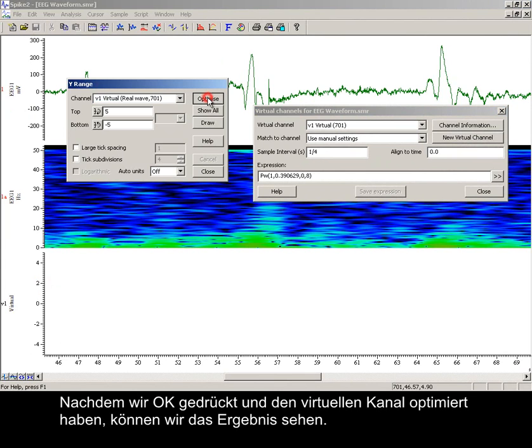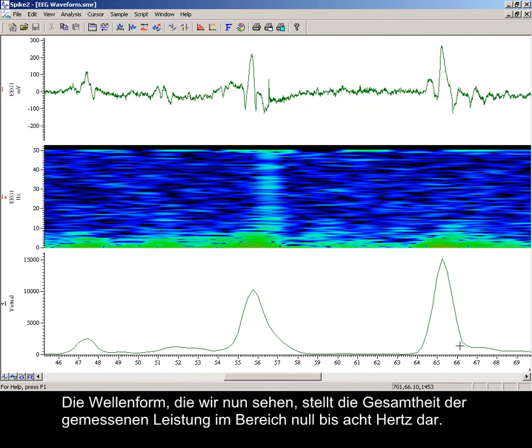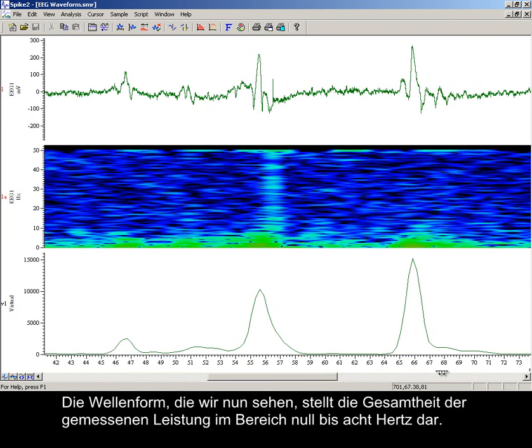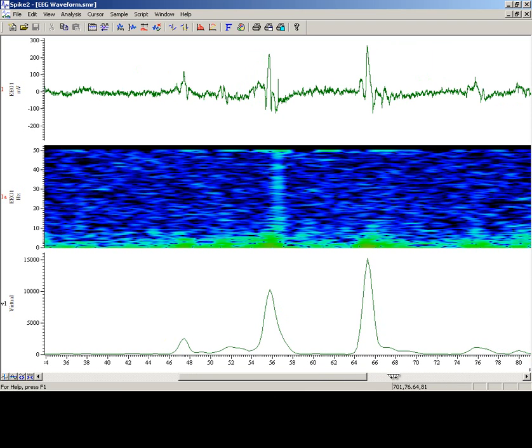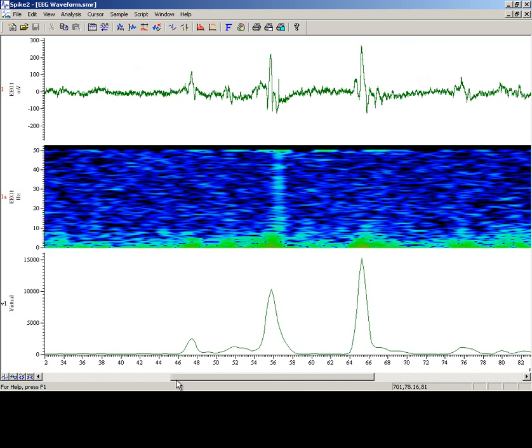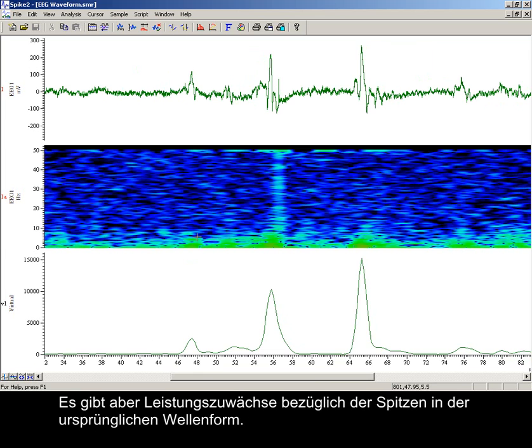After pressing OK and then optimizing the virtual channel, we can see the result. The waveform we now see is the total measured power in the range 0 to 8 Hz. As you can see, there is little activity in this frequency range from 32 to 46 seconds, but there are increases in power corresponding to the peaks in the original waveform.